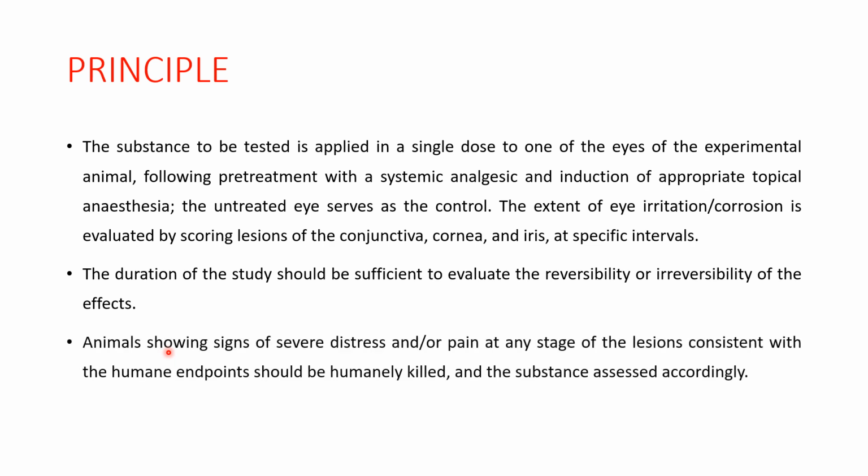effects. If an animal shows signs of distress or severe pain at any stage of the practical, then in such a case we will humanely kill the animal and the substance is then assessed accordingly.